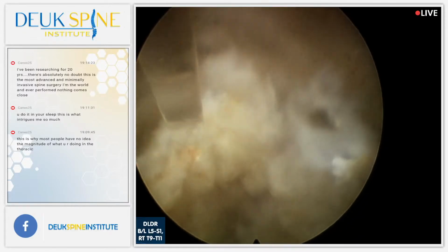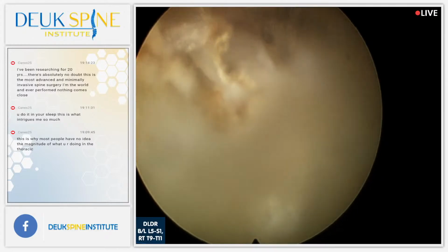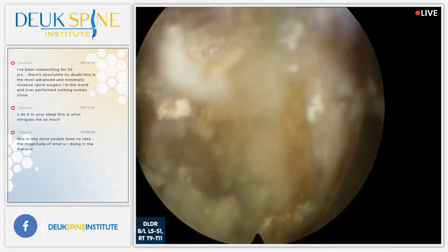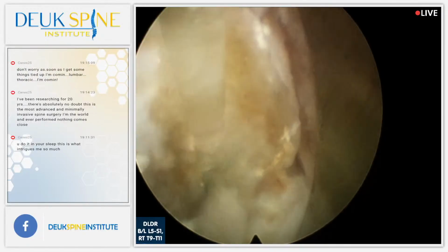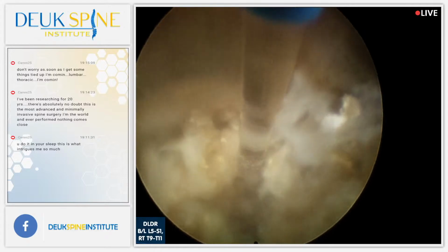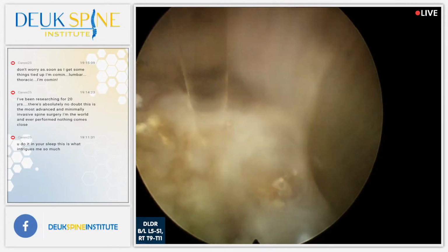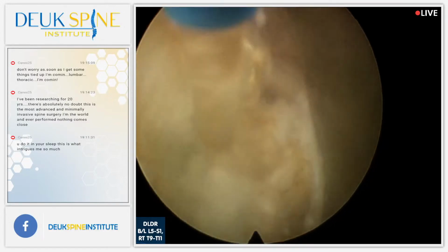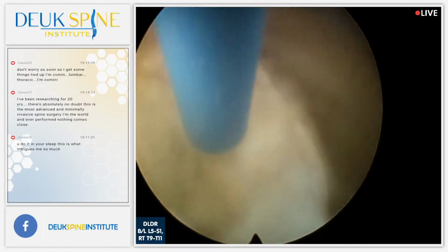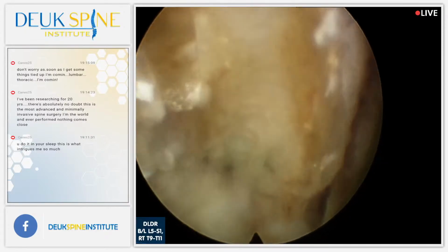99.9% of doctors would ignore it. They would say, look at that disc, there's nothing wrong. Mild degeneration, if anything. That's how our radiologist read it. But I knew there was something more to the story. So I went back and I said, are you sure? Can you see these degenerative changes here in the front? And he said, yes, you're right. I said, well, don't call it normal if it's not normal. That's the problem with radiologists. They want to call everything normal when it's not normal. Because the problem is if they call everything abnormal, then the doctors are going to start ordering more tests unnecessarily, usually. So they want to minimize what they call abnormal to what's really, really abnormal, right?